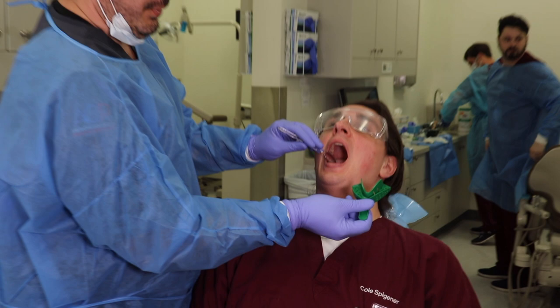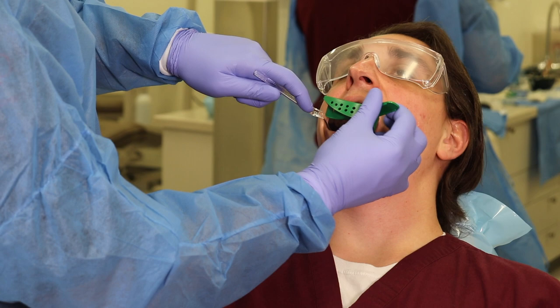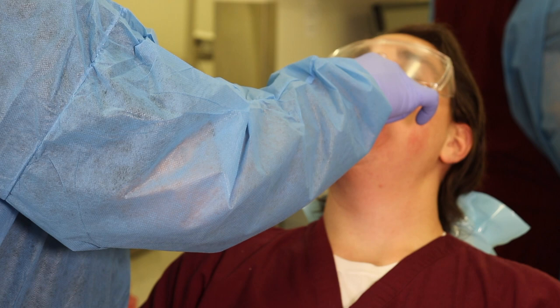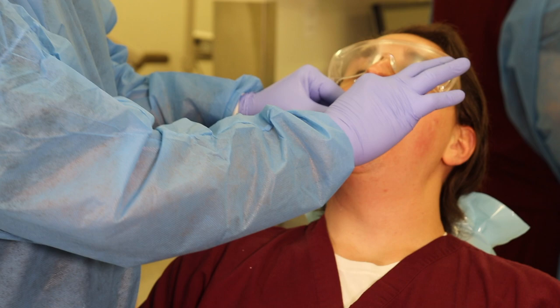What I like to do is retract with the mirror on one side, and then as I'm retracting on that side with the same tray, I retract the other side, have it there, and make sure this tray fits comfortably. It wobbles a little bit. And most important, that it covers most of the teeth, okay?